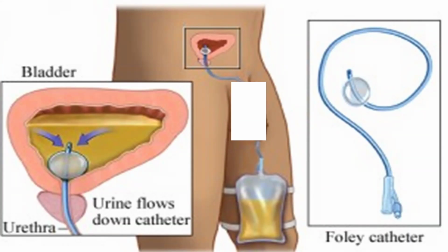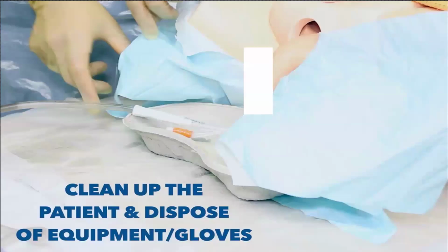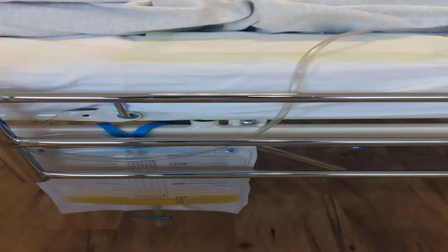Now you do that to achieve two things. First of all, you want to make sure that it's below the level of the urine so that gravity helps do the work. And then again, to make sure that the tip of the catheter does not touch the bladder wall, which could cause bleeding, discomfort. Then you connect the urine bag below the level of the patient. And then you want to check the residual volume. And then, after that, you cover the patient up.